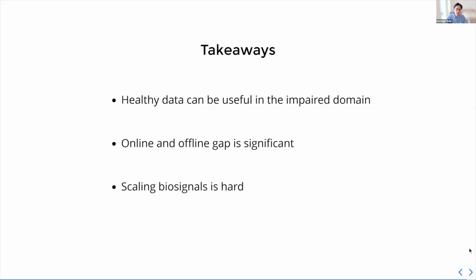And all of these are great, except that when you're trying to train a robust model, you do not have enough data to help support your training, right? So in our case, the EMG armband we use, the Thalmic Myo, we're really sitting on top of 10 years worth of open source data. And I think that's a big reason of why this method works.